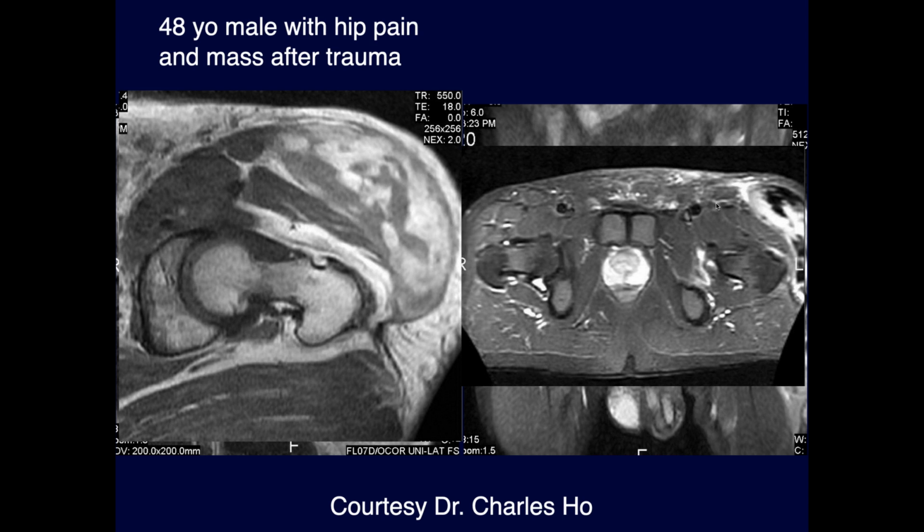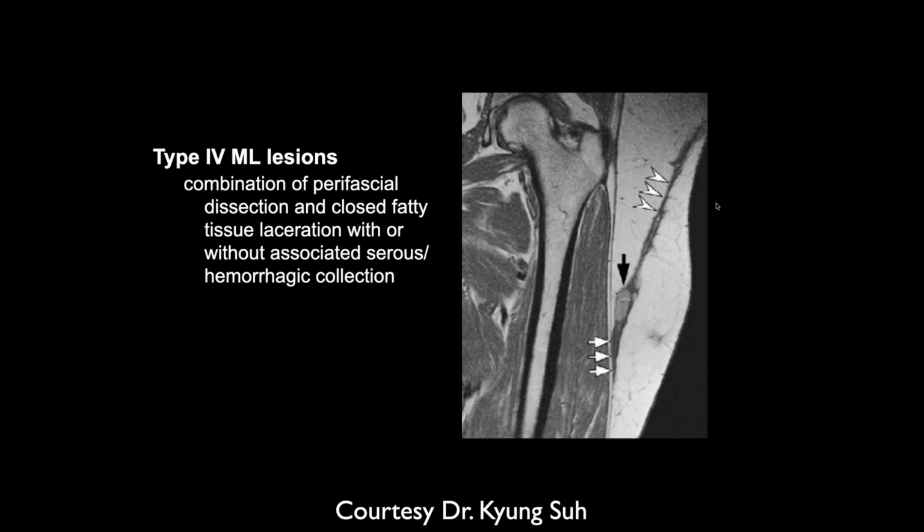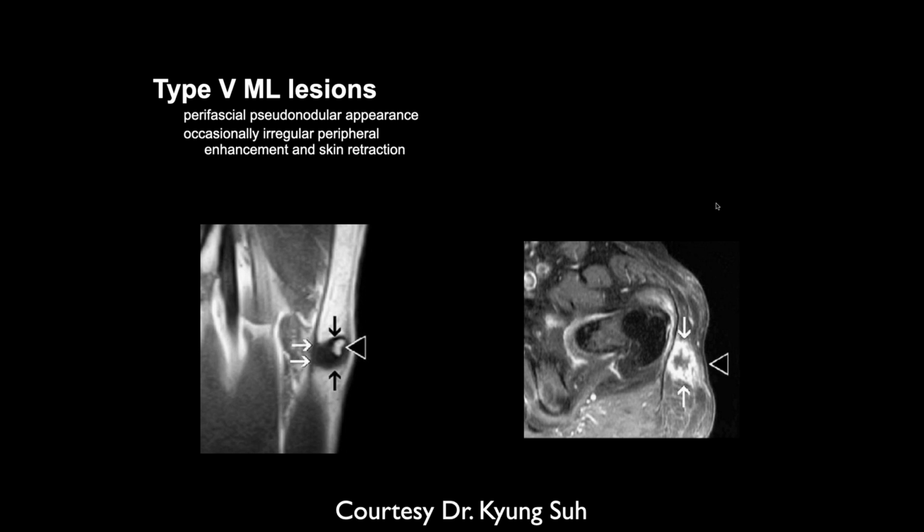Heterogeneous. This could be another Morel-Lavallée lesion along the thigh, the lateral thigh here. This is a little bit more chronic. A lot of different components to it. Same treatment. Yep. And the different grades.